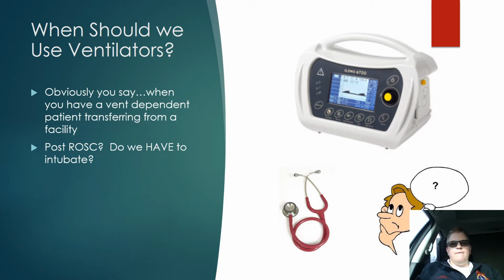So if we can set up the vent, put PEEP on, do all the things that we can to help properly ventilate and better ventilate our patients.